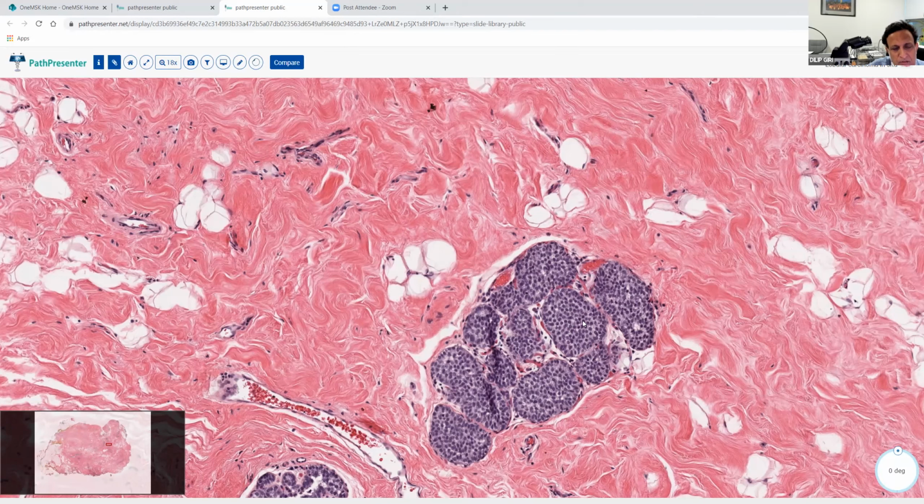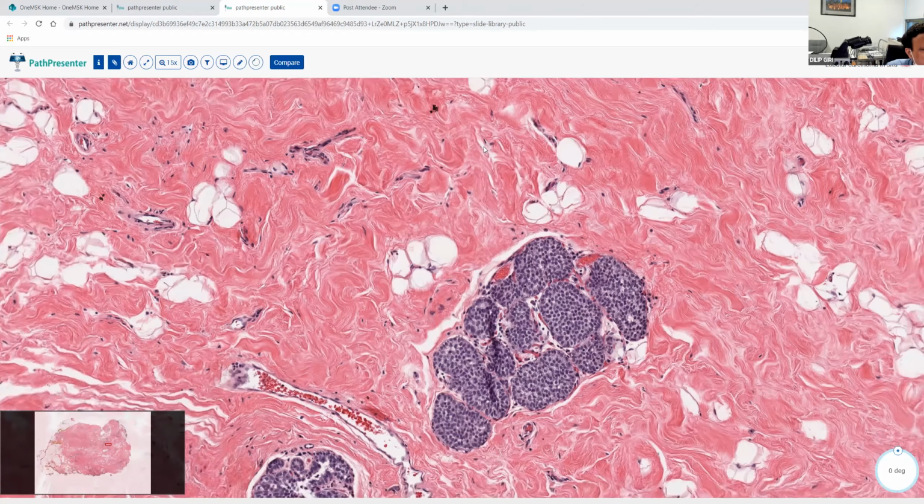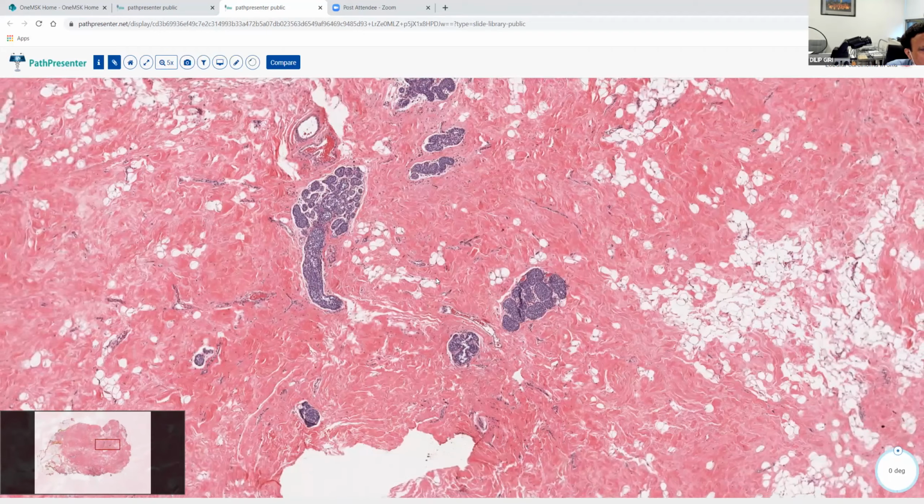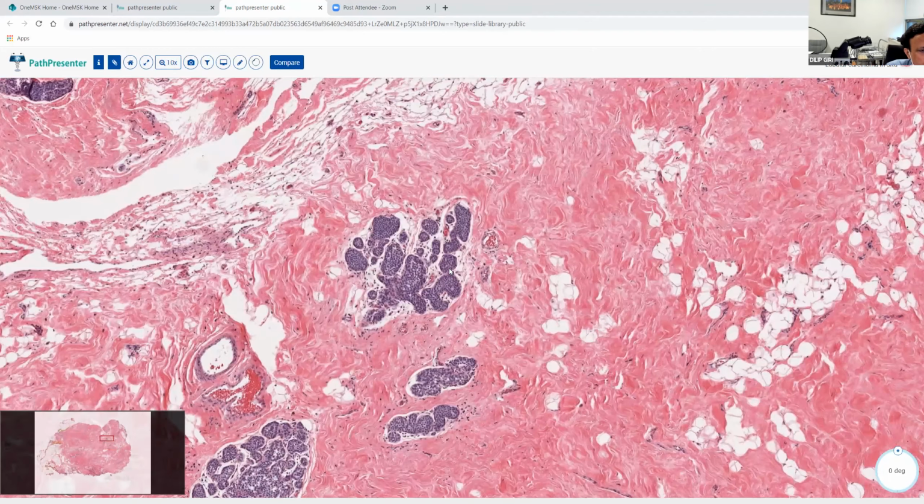If we think something is classic LCIS, we will just say so. If the cells appear unusually large, we may say that the cell size appears larger than usual, but it has no special significance unless the setting is that of florid LCIS or pleomorphic LCIS. Otherwise, classic remains classic. So all this is the so-called type A classic LCIS.